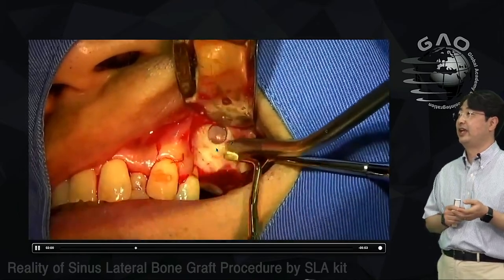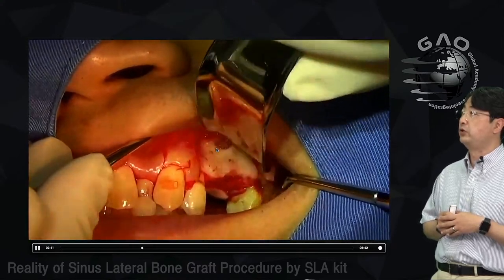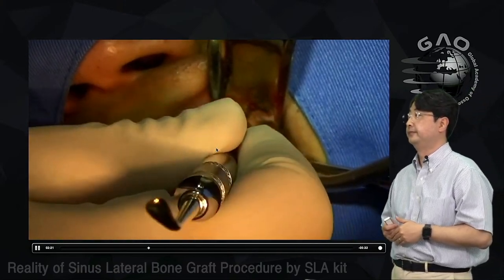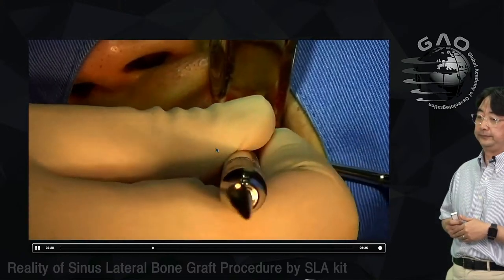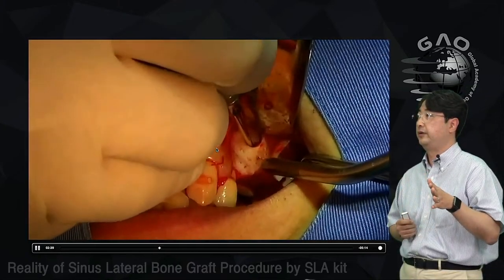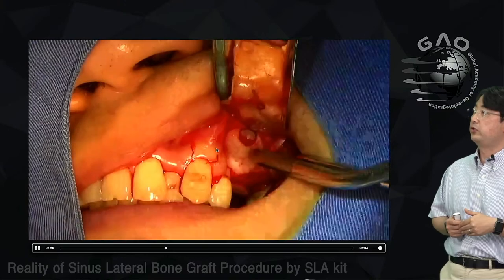So what's next? Next will be number two. Still, I'm using number one. Now I have number two. You see this rectangular part, I go down from the window to the crestal part. My hand covers it, right? Once I finish with number two, I use the other side to go further. Now I'm touching the crestal part of the maxilla with number two.